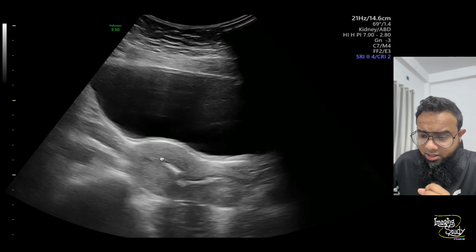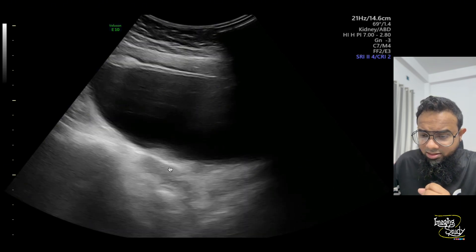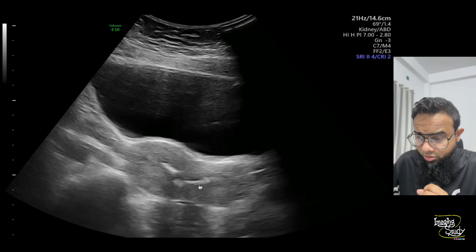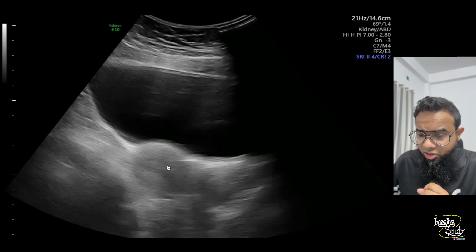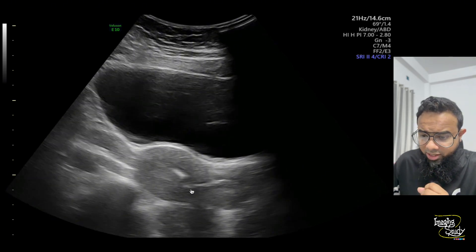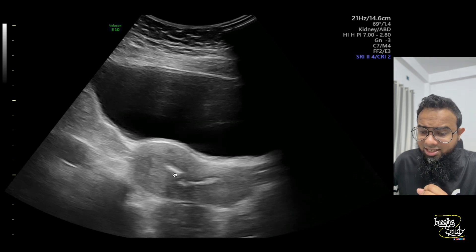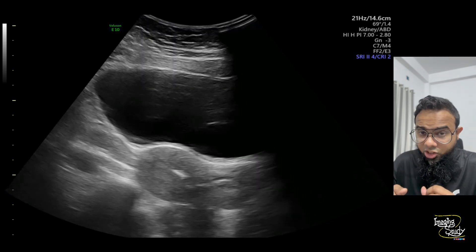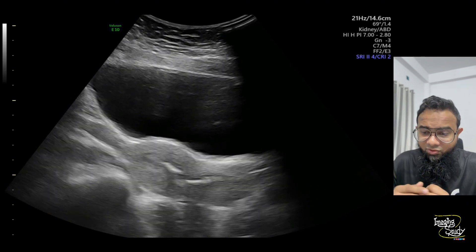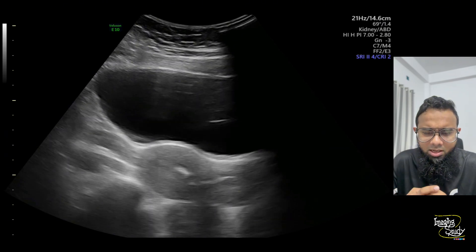Here you can see the longitudinal section of the uterus and the endometrial lining. There are some echogenic linear structures along the endometrial lining, and you can see some faint posterior acoustic shadows from these areas. These echogenic structures are nothing but endometrial calcifications — very strong, bony-type calcifications.